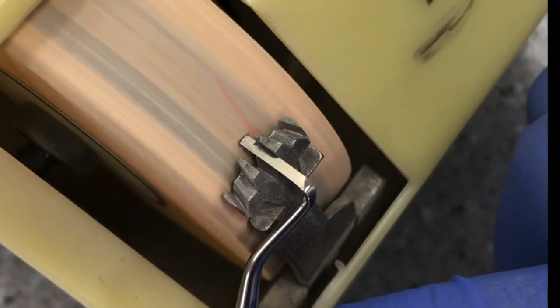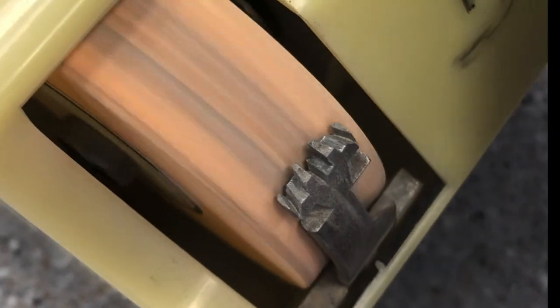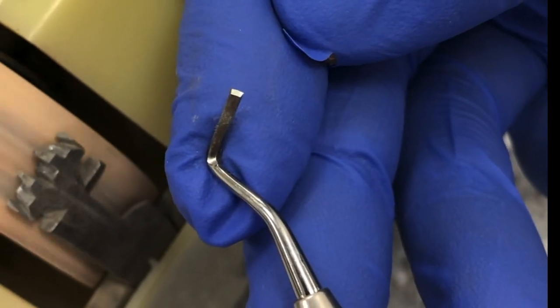Using light and even pressure, you'll notice a small amount of filings being created from the sharpening of the edge. Periodically remove the instrument from the sharpening machine to ensure that the blade is being sharpened in the right angulation.